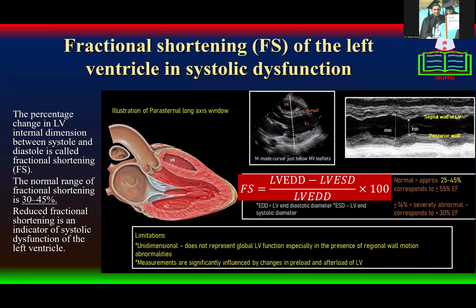In systolic dysfunction, this fractional shortening will be reduced, right? And the fractional shortening can be calculated from the internal ventricular dimension during diastole and during systole.